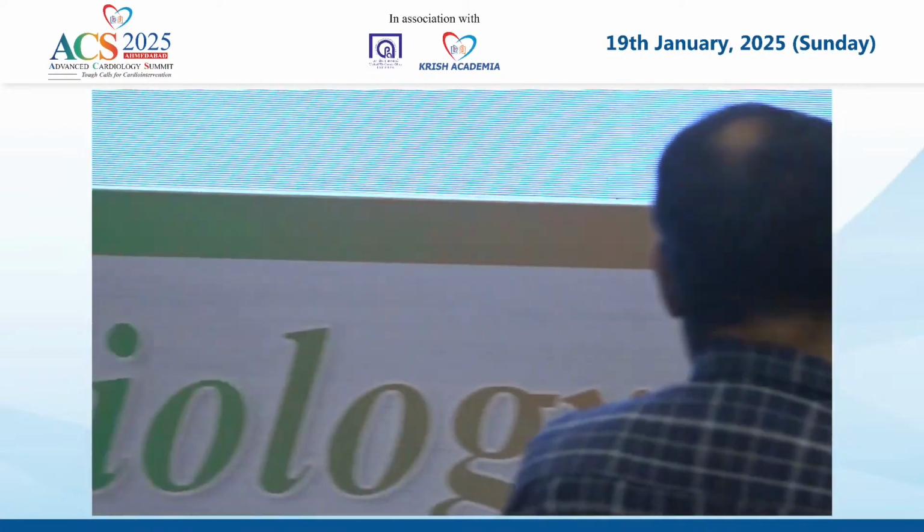IMR? Yeah. So I'll take the second question first. We were actually trying to work with IMR before the RADI wire was taken off, and we were impressed by the amount of prognostic information one got from microvascular disease. I think that's a great question. We still don't yet have an answer, but we do know that when the IMR is beyond 40 in acute myocardial infarction, the event rates are 17 times higher than if they are lower. And we also know that if your IMR goes more than 30, the false negative rate of the FFR seems to go up. But these are the only two things we were able to establish before the RADI wire was pulled from India.